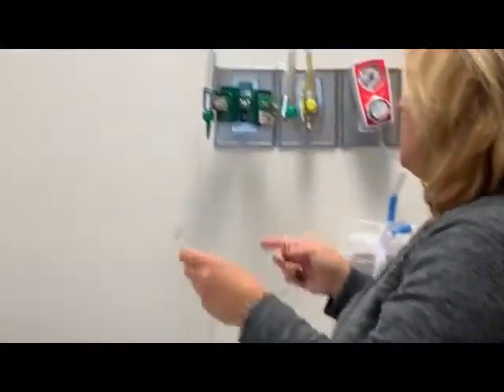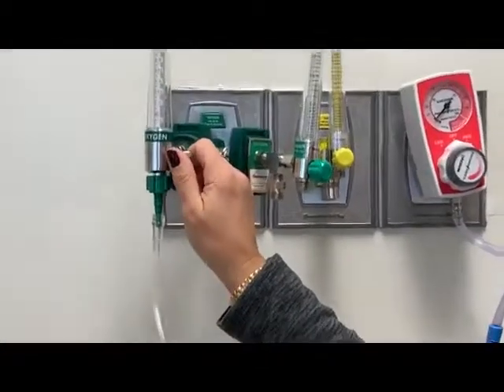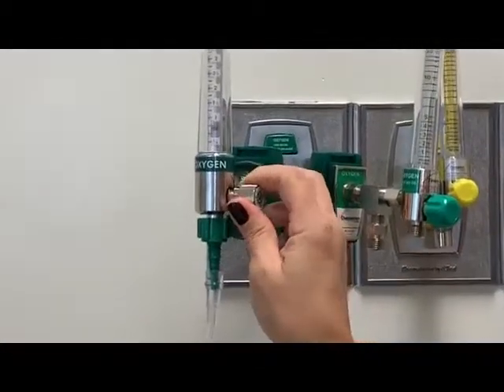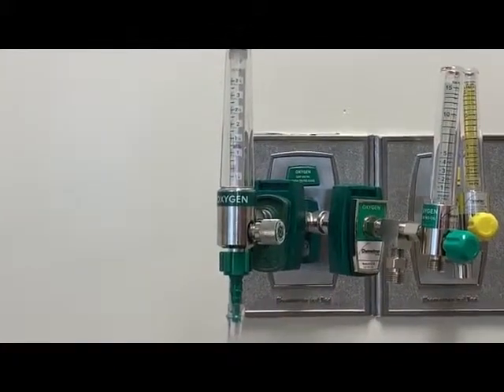When I hook up my nasal cannula, I'm going to connect to the tube on my device. I'm going to dial in the liter flow, like if I wanted to use 2 liters for my patient, I'm going to dial that up to 2. I always want to make sure that I'm getting some flow out of my nasal cannula before I place it on my patient.